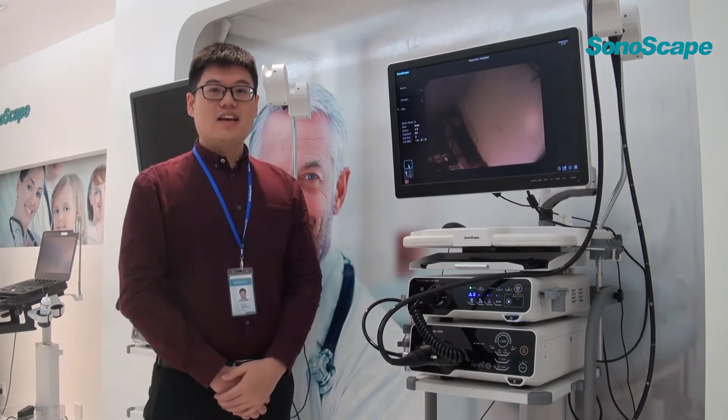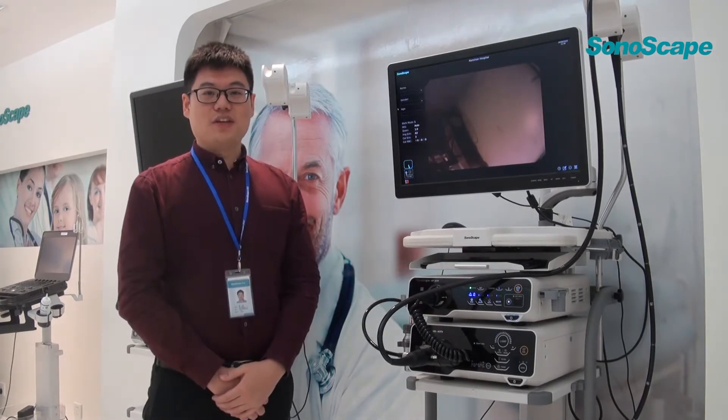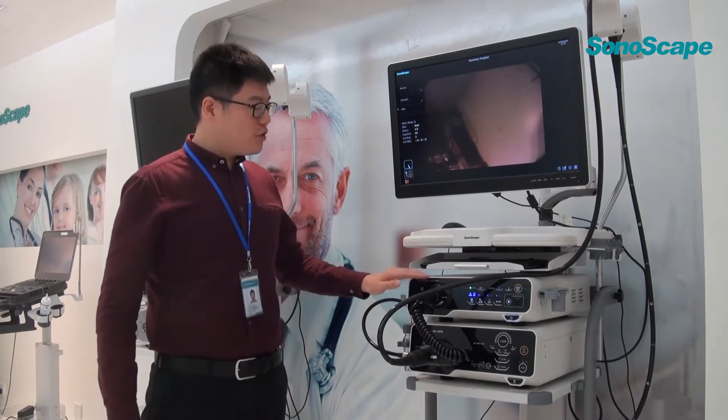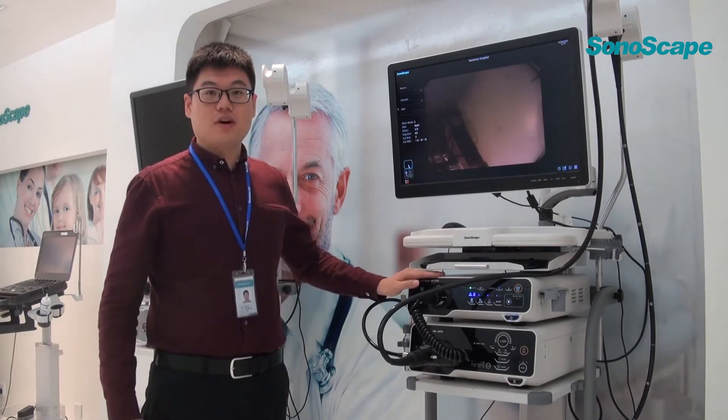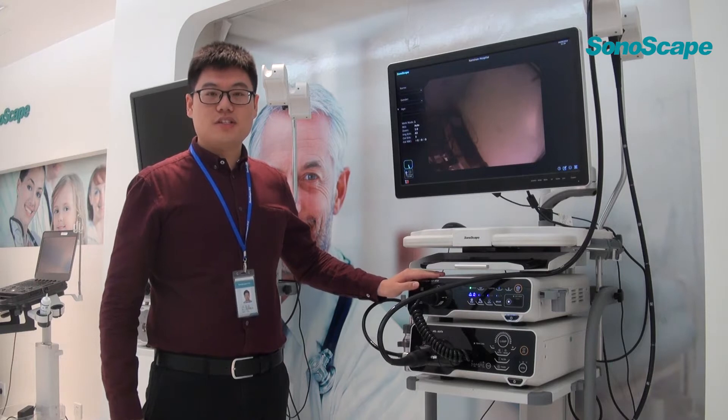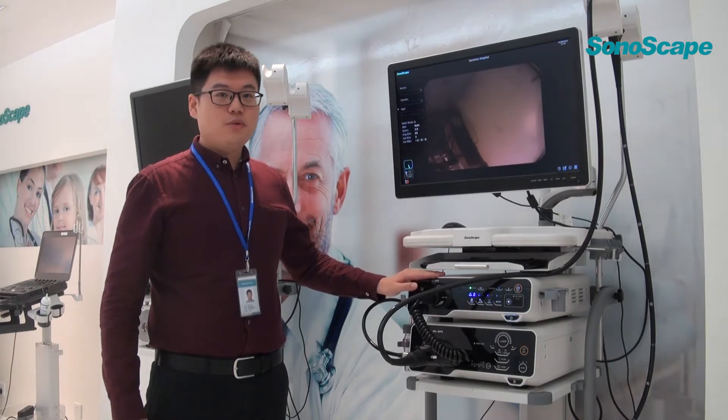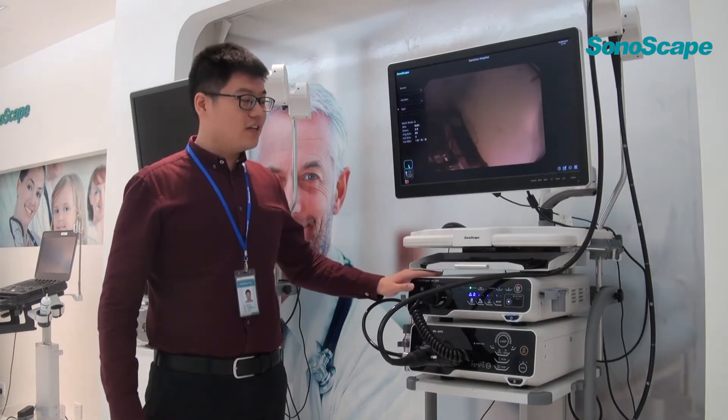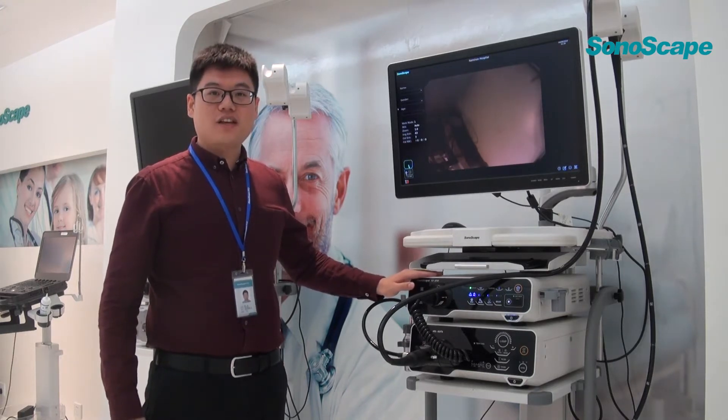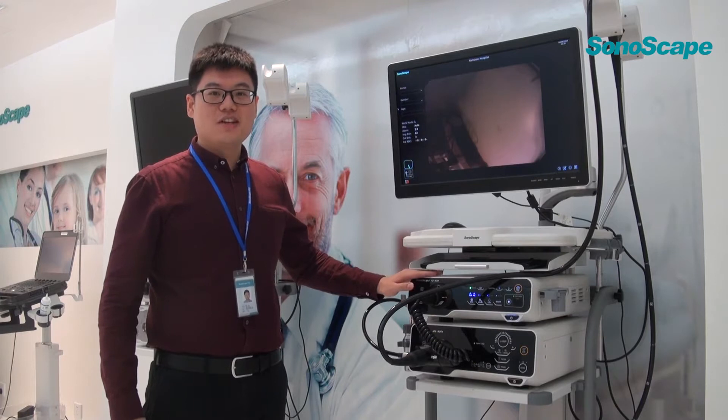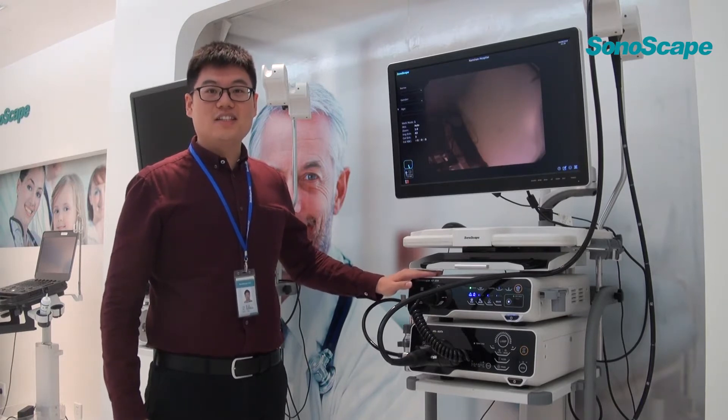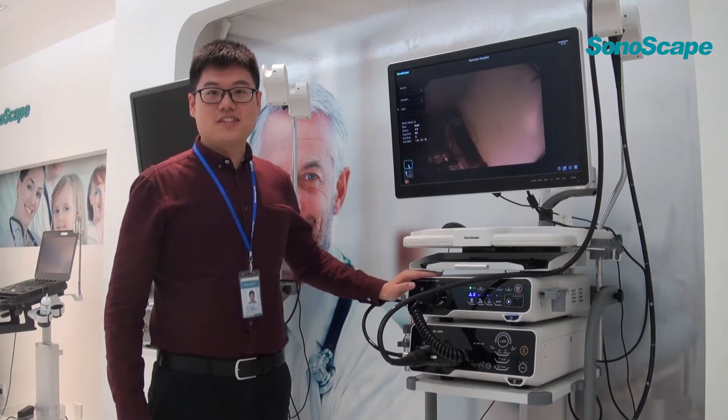And second, for the image processor, it is equipped with 500GB storage of built-in workstation, which can provide an intelligent solution for saving images, recording the videos, and editing the reports.